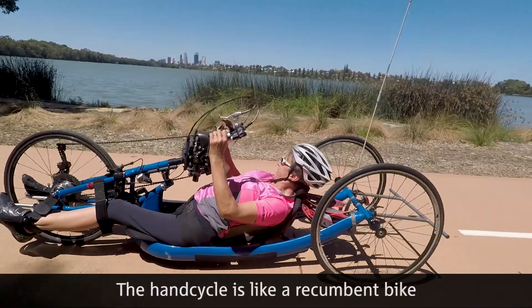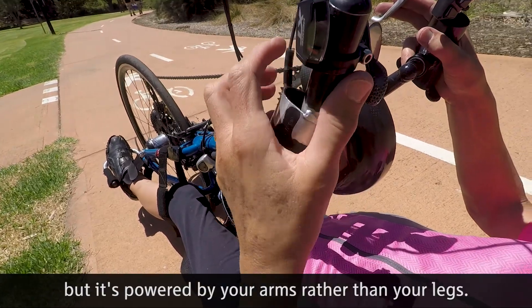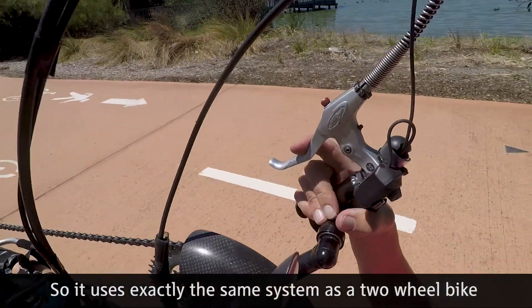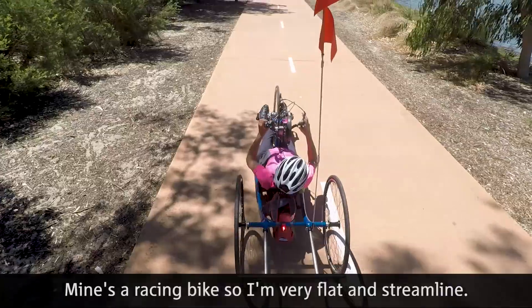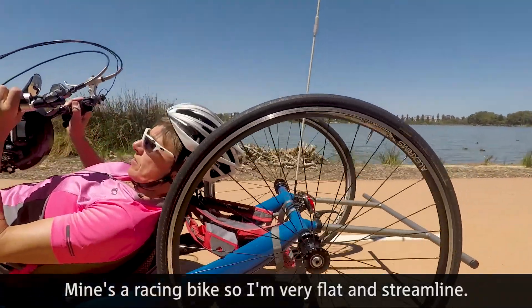The hand cycle is like a recumbent bike but powered by your arms rather than your legs, using exactly the same system as a two-wheel bike. The type of bikes vary greatly — you can be sitting almost upright. Mine's a racing bike, so I'm very flat and streamlined.